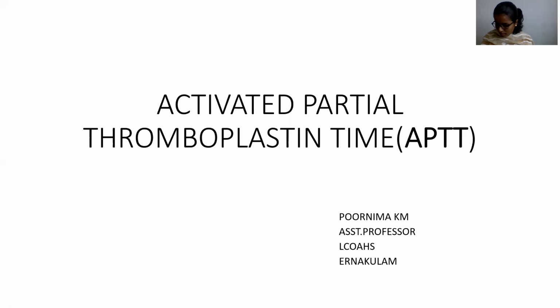Good morning all. Today we are going to discuss activated partial thromboplastin time, that is APTT. This test is mainly done to detect whether there are any deficiencies of coagulation factors involved in the intrinsic coagulation pathway. Okay. So before discussing the APTT, let's have a look at the coagulation cascade.